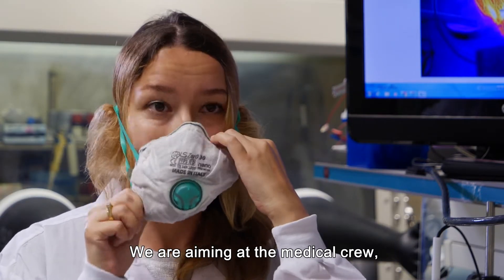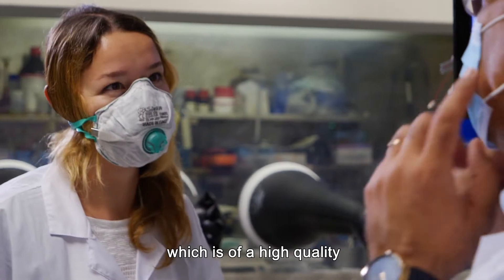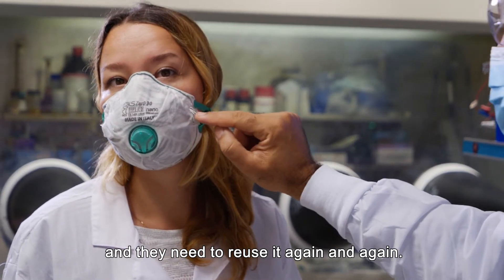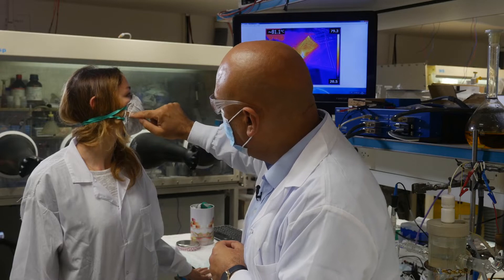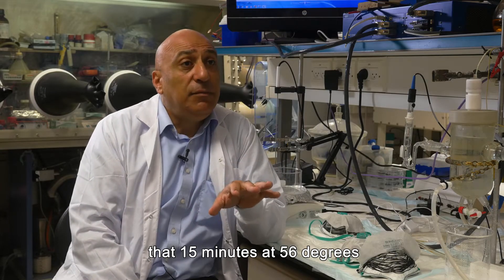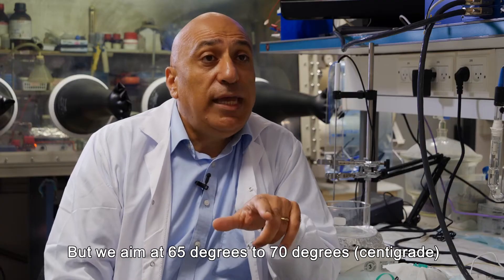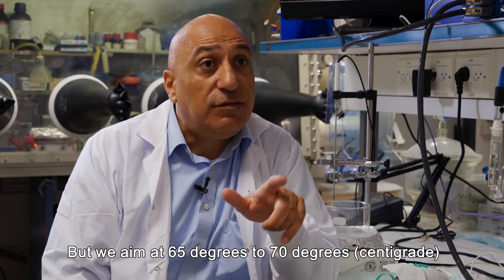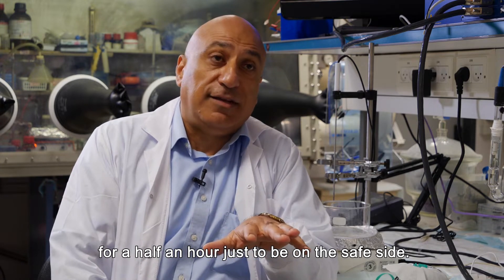We are aiming at medical crew — people that are in need of a high quality mask and need to reuse it again and again. The health organization reported that 15 minutes at 56 degrees would be more than sufficient, but we aim at 65 to 70 degrees Celsius for half an hour, just to be on the safe side.